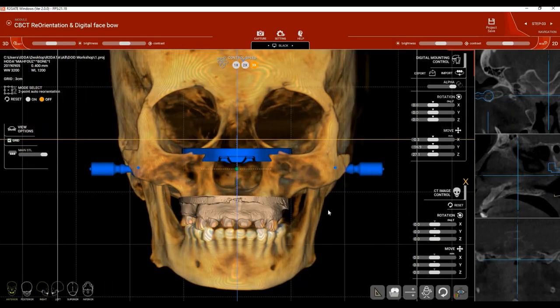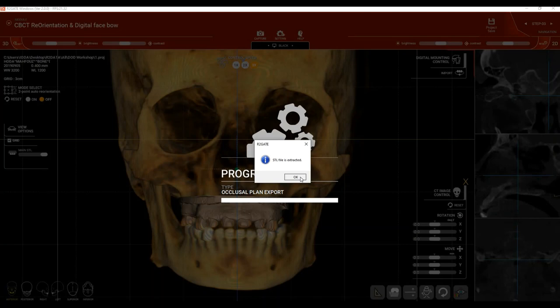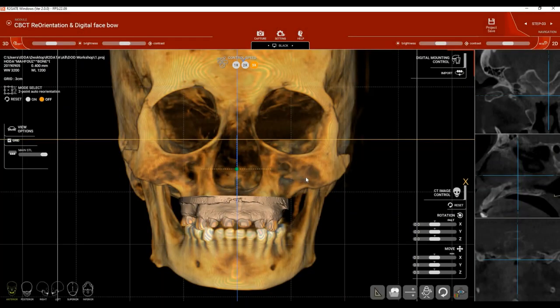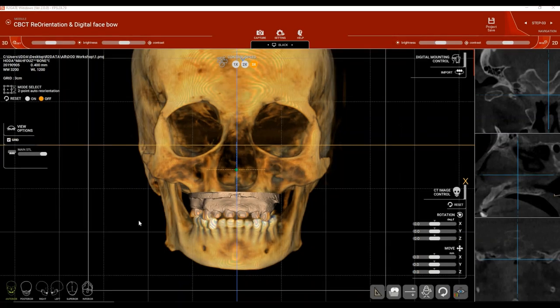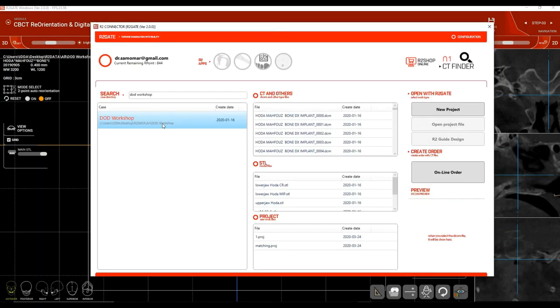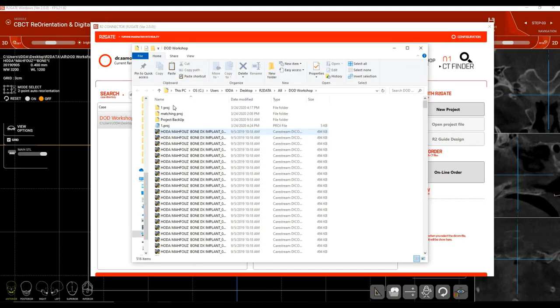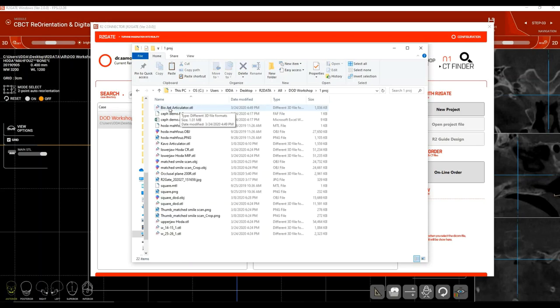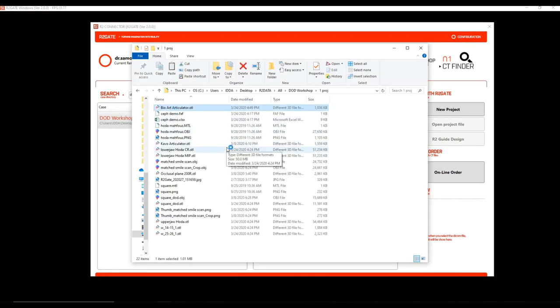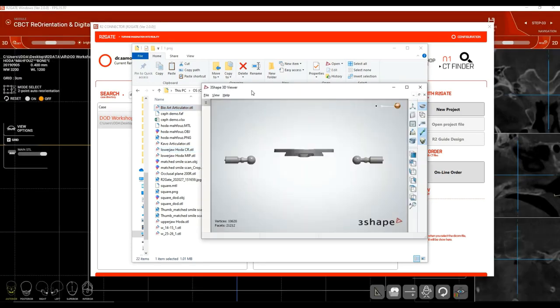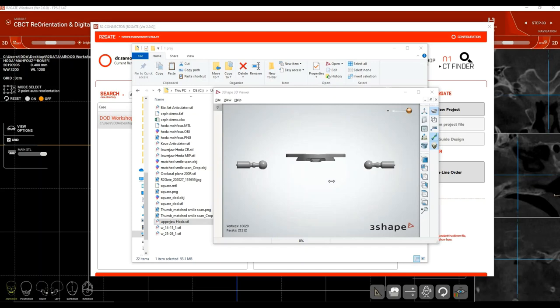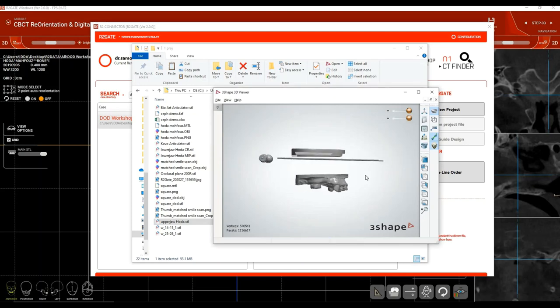To export your digital face bow, click Export in the middle of the screen. The software exports the file as an STL file viewable in the patient's folder. To find it, go back to the ArtiGate Connector, double-click the case on the left side, open the first project folder — inside you'll find the BioArt Articulator and the upper model of the patient. These are the files you use to mount the case in the digital articulator in your CAD software.